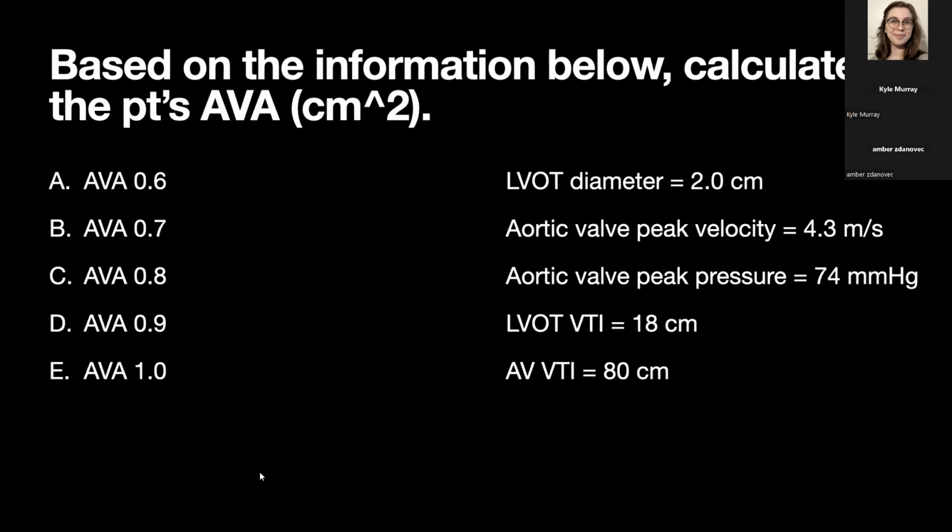So written question all the way, so you don't really ever look at peak aortic valve gradients, just mean gradient? Per the guidelines, yeah, that's what the guidelines include.